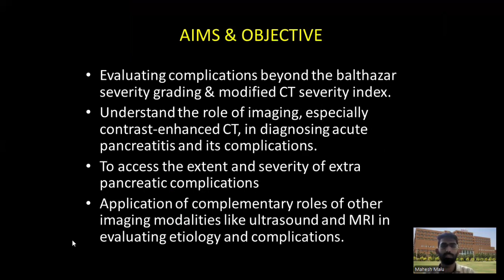The aims and objective of my study, the paper, is evaluating the complications much beyond the Balthazar severity grading and the modified CT severity index, and understanding the role of imaging, especially the contrast enhanced CT, in diagnosing acute pancreatitis and its complications.